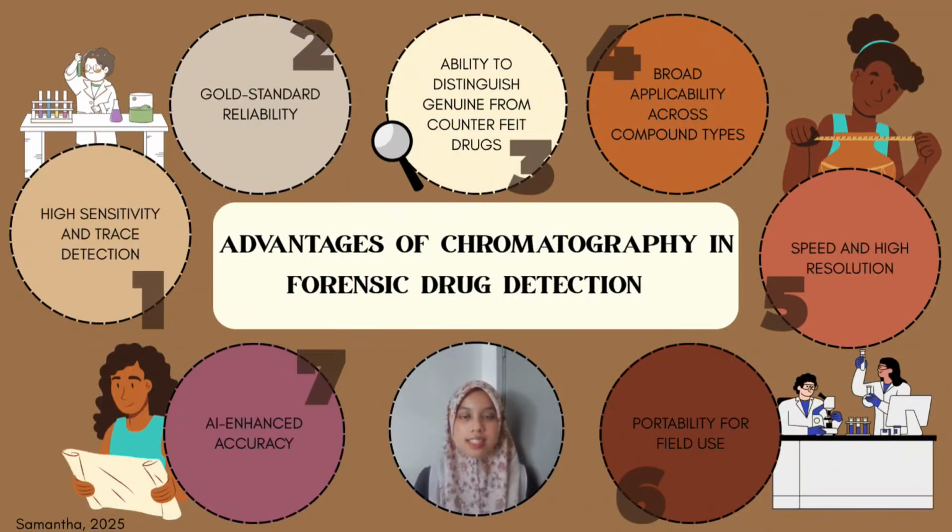Let's discuss the advantages of chromatography in forensic drug detection. First, chromatography offers high sensitivity and trace detection. This means it can identify extremely small amounts of drugs, even when only trace residues are present on clothing, surfaces, biological samples, or evidence collected from crime scenes.